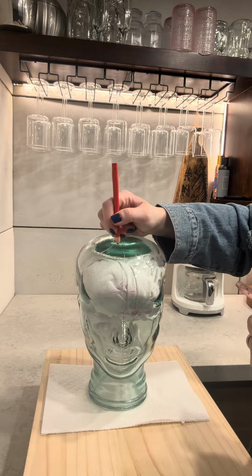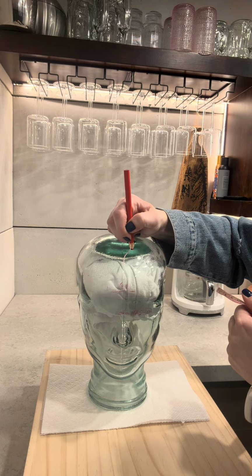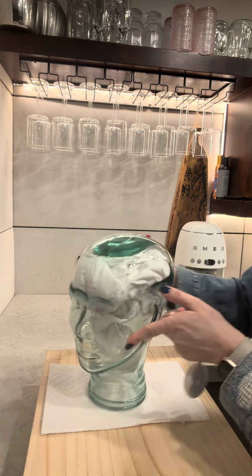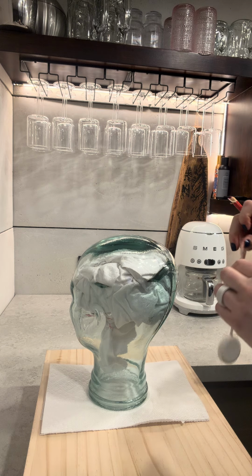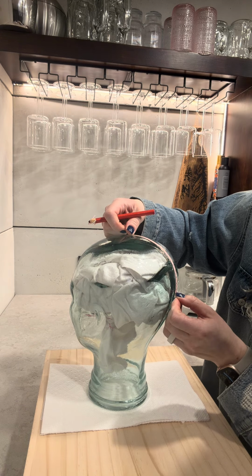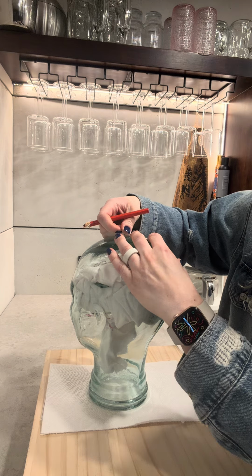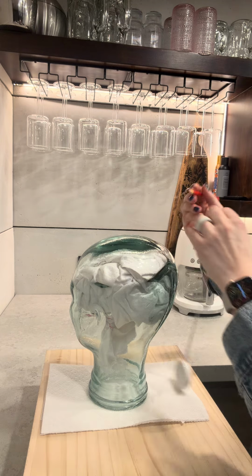And that's my Fz. Cz, and here from Oz to Cz, half of that is 7, and that's my Pz.